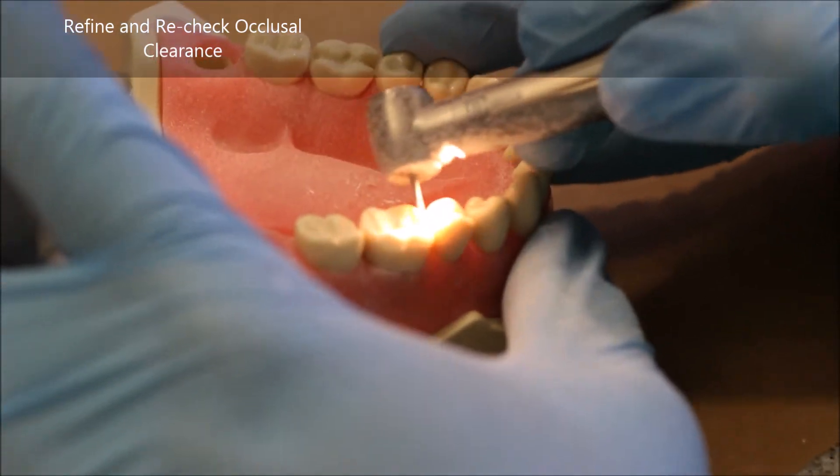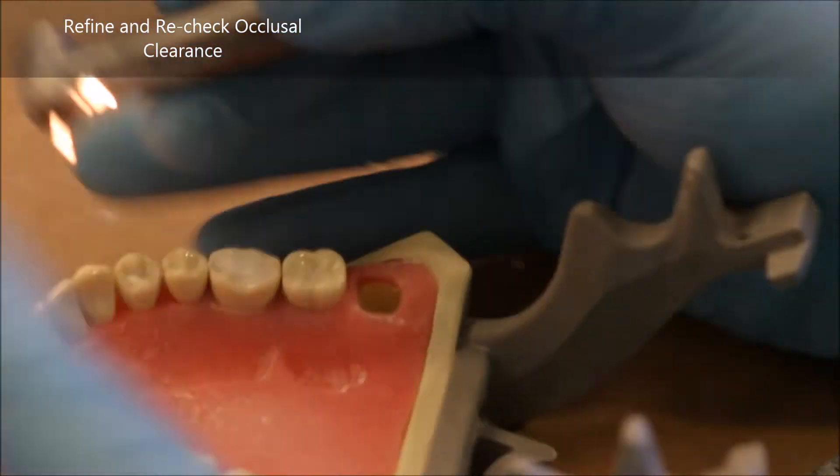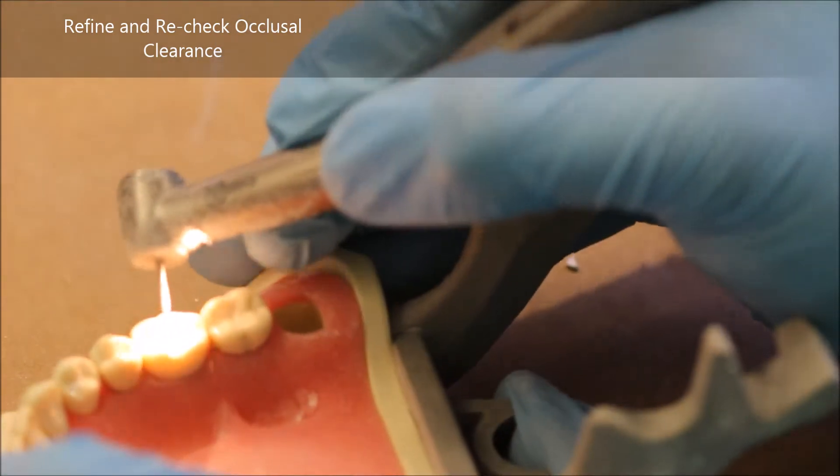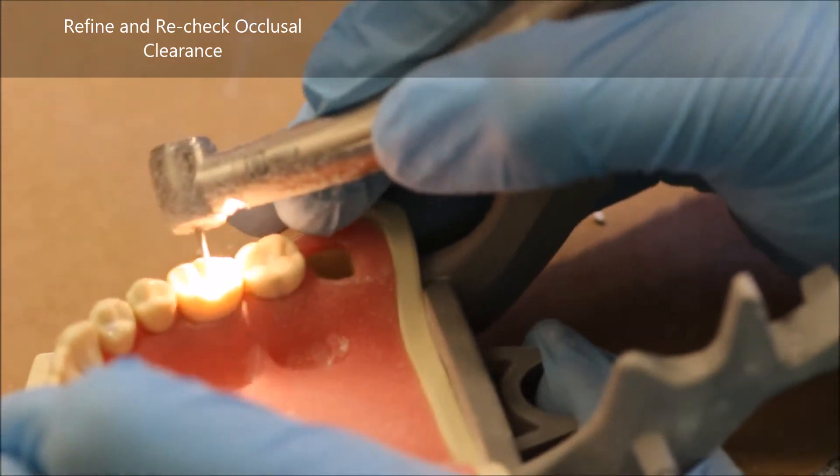A quick note about checking occlusal clearance: when you have done a sufficient amount of occlusal reduction, the 1.5 millimeters is checked by using your RGS3. Your RGS3 needs to be very loosely able to fit in between the teeth.